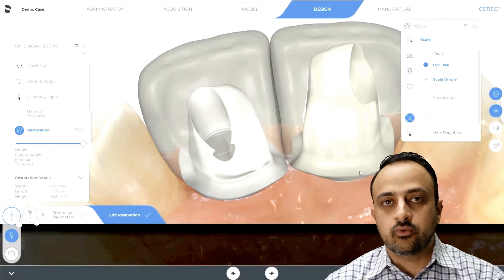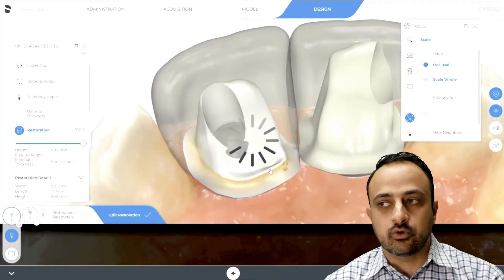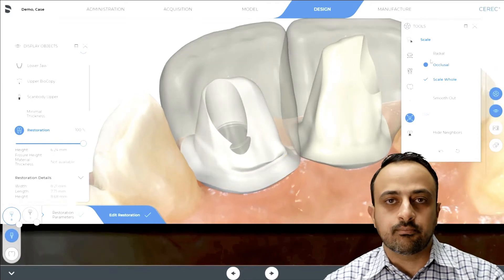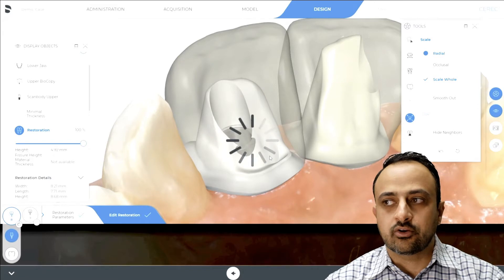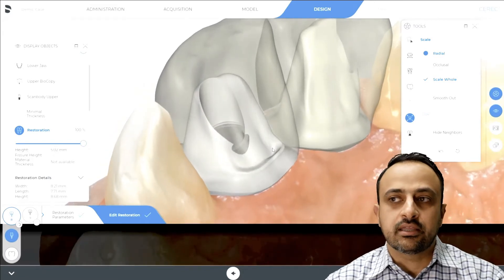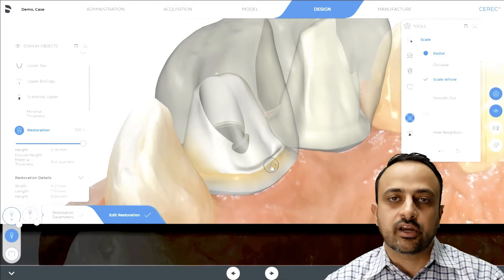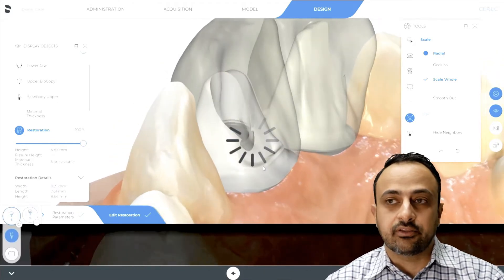Typically when you split your restoration you may not get the most ideal design for the axial walls of your cement retained abutment. If you notice here, there are these little wrinkles at the base near the margin, and it can be difficult to remove and correct them. If you try using the scale occlusal it can end up making it worse, and sometimes using the scale radial doesn't correct it exactly the way we want.